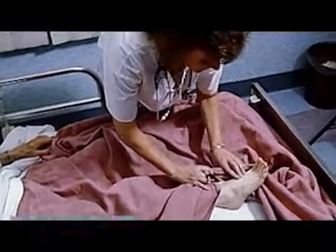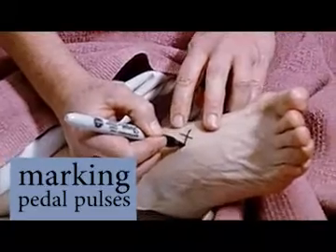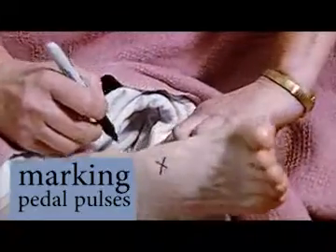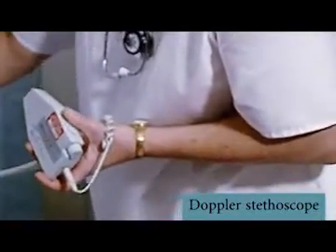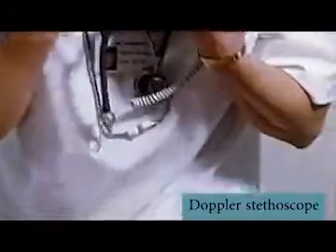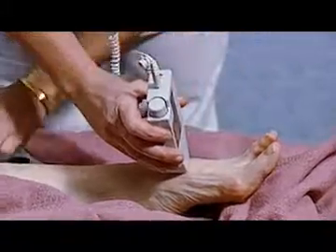During the physical assessment, a mark is usually made at the sites where pedal pulses are palpated with a skin marking pen. If you are unable to palpate a pulse, a Doppler stethoscope should be used to locate one. If lower extremity pulses are absent, it is important to document that fact and notify the cath lab nurse of this finding.